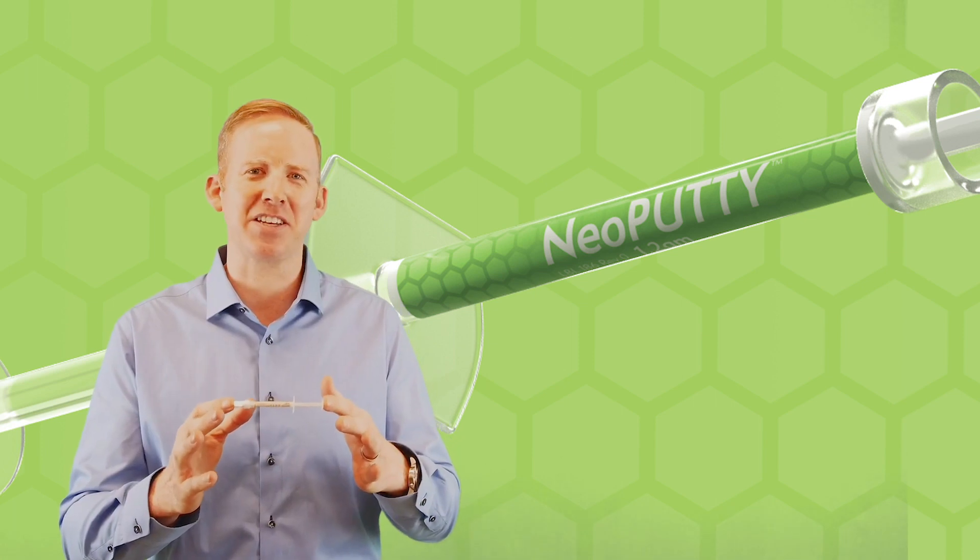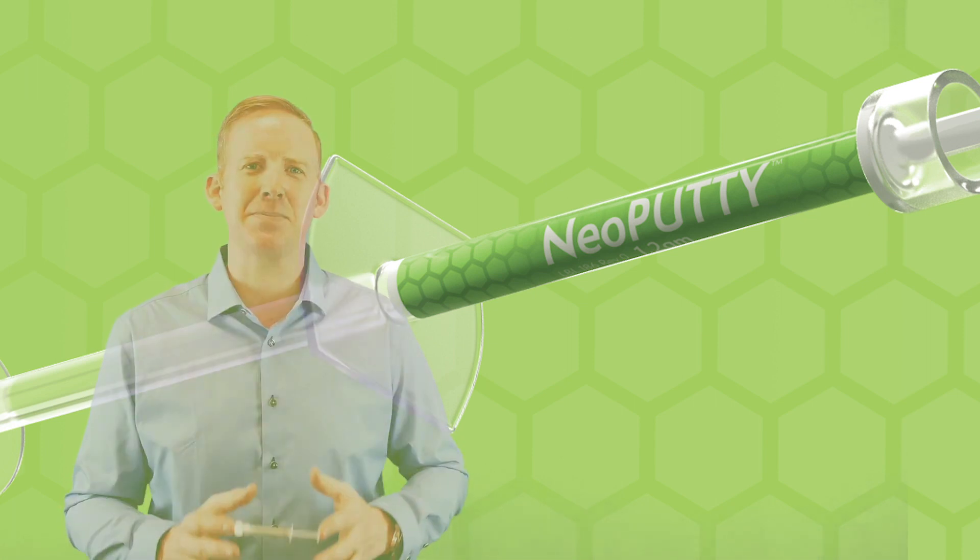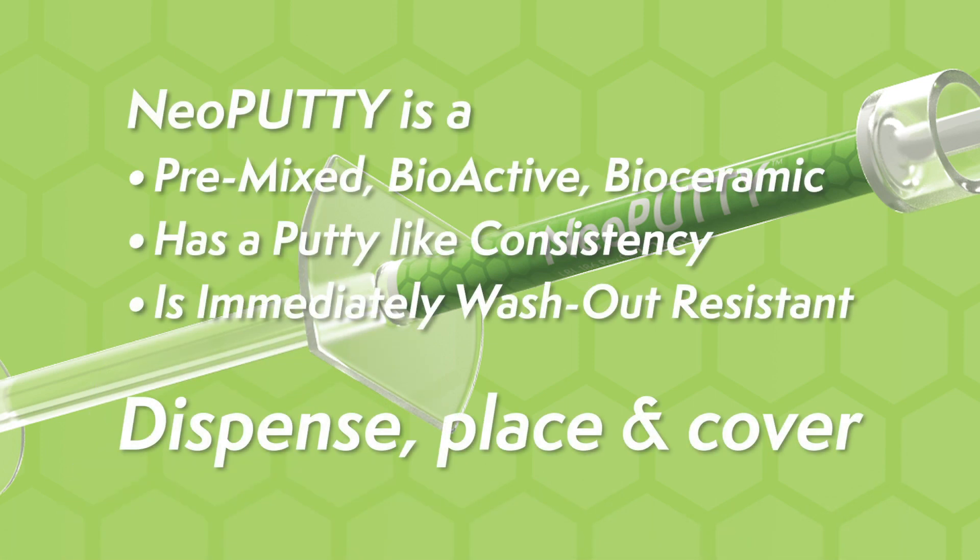So let's talk about what's in this great product. Neoputty is bioactive, premixed to a firm putty-like consistency, creating a washout-resistant material, allowing you to dispense, place, and cover with your preferred restoration.